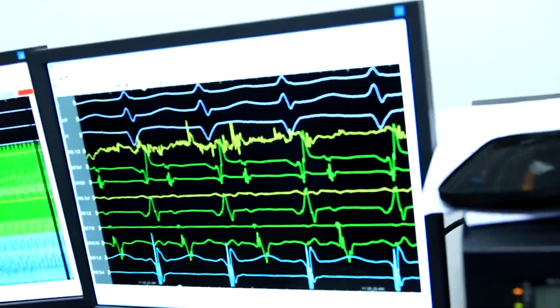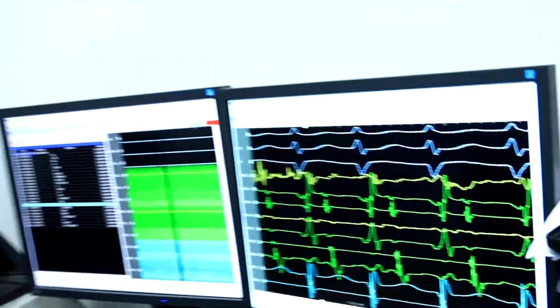I paced from the left ventricle by the ablation catheter placed in the left ventricle, and I saw a very short VA time. This is the clue, the key to this tachycardia. And then we started to think it's AVRT, not an atrial tachycardia, because every time we do RV pacing from the right ventricle, you get a VAV response. We never got a VAAV response.